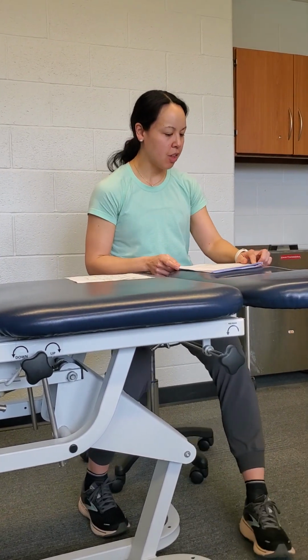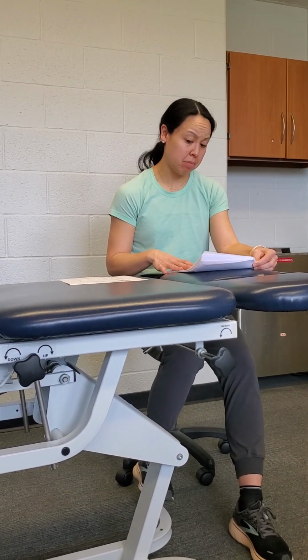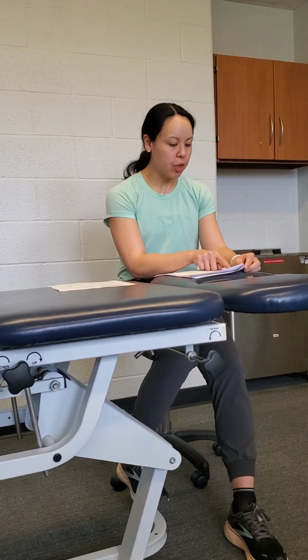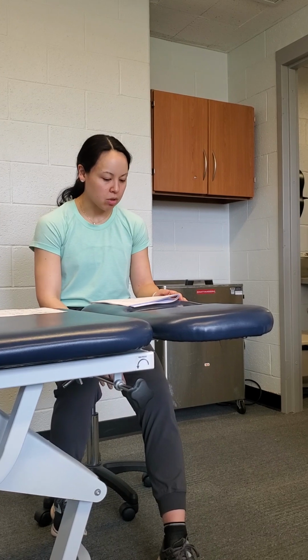Okay, so there are three different types that we're going to be using the BFR for. The first one is passive, and that's really talking about early stage, those post-op patients who are coming in within the first week of their surgery. They're in, maybe more for pain modulation, they can't really do much, they're not comfortable, and you're just going to put them on the machine, they're going to lie there and do nothing. So that's passive. They're really not doing any type of exercise with it, or they could be doing some quad sets or ankle pumps and things like that that are really tolerable for them.